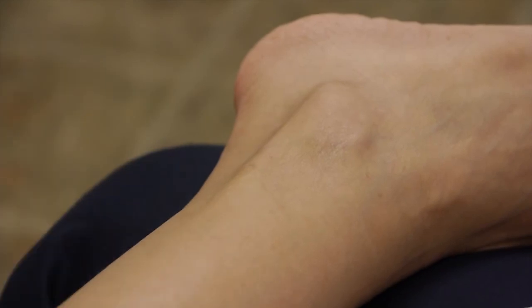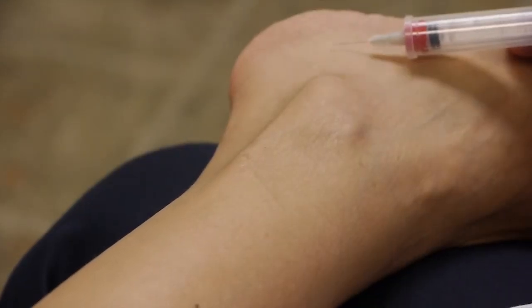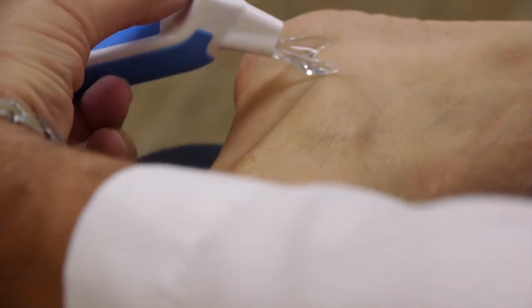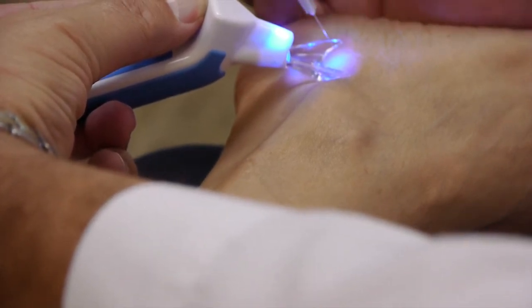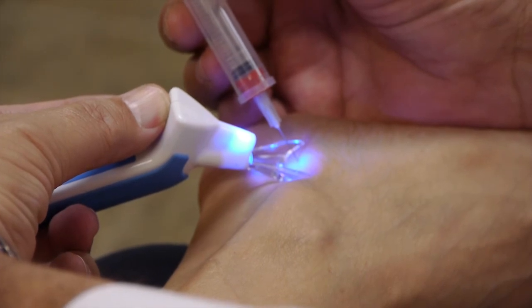With respect to the sural nerve, which we know is approximately 1.5 centimeters distal to the most distal aspect of the fibula, we know that it courses around the fibula at this spot right here. So if I want to hit the sural nerve, I can inject right here. And I know I'm into the sural nerve at that spot.